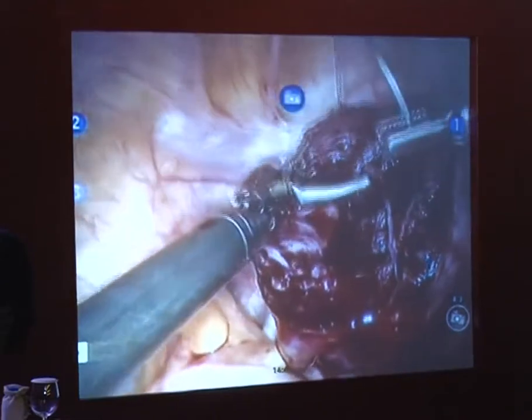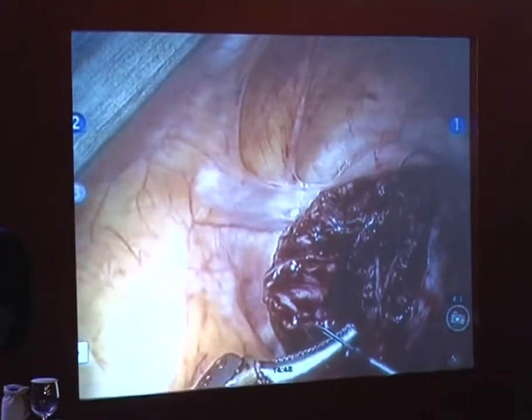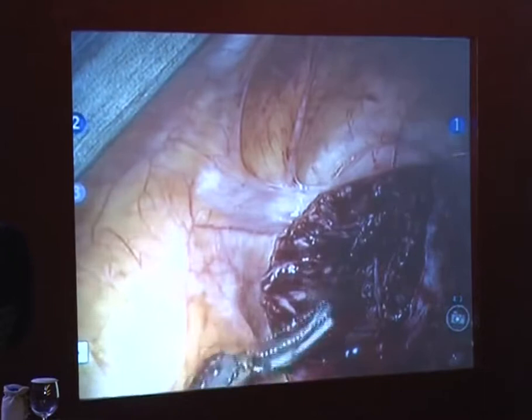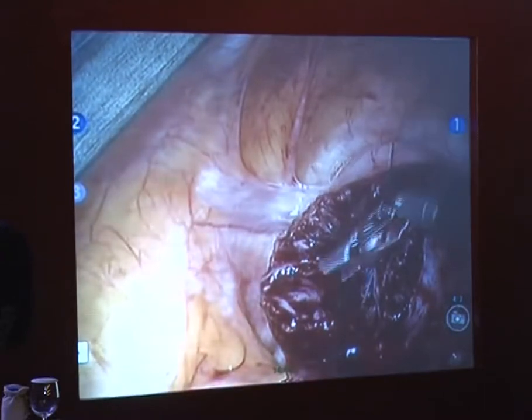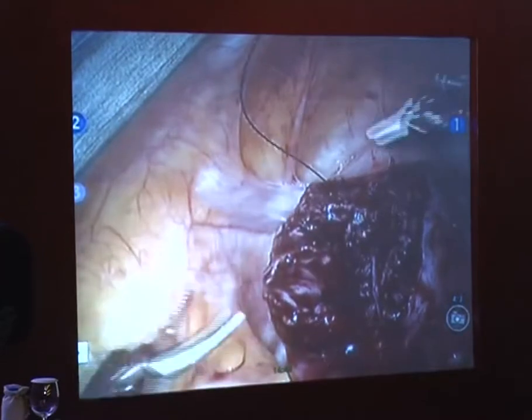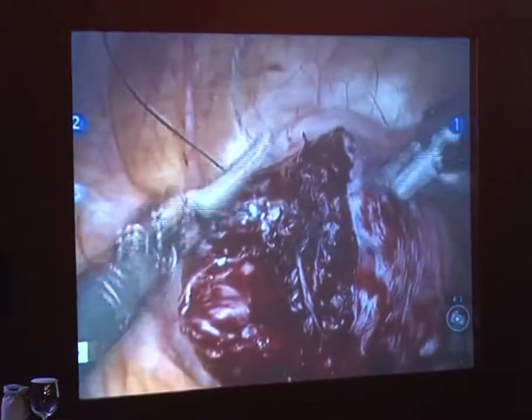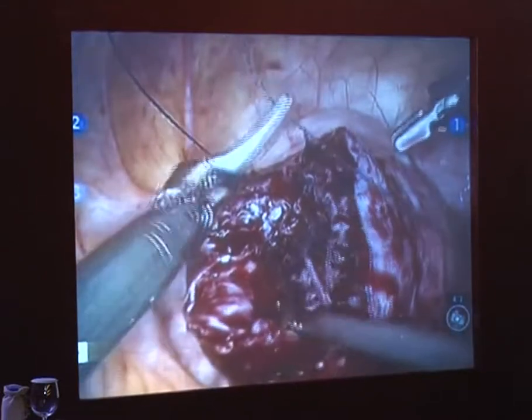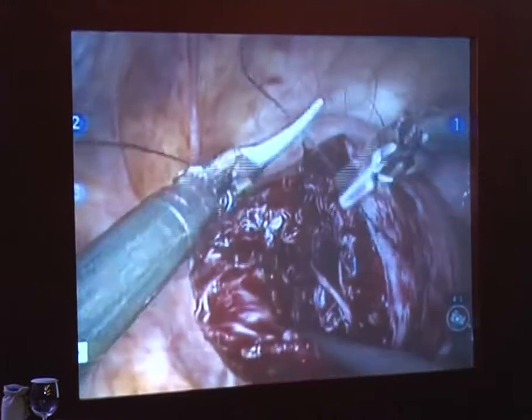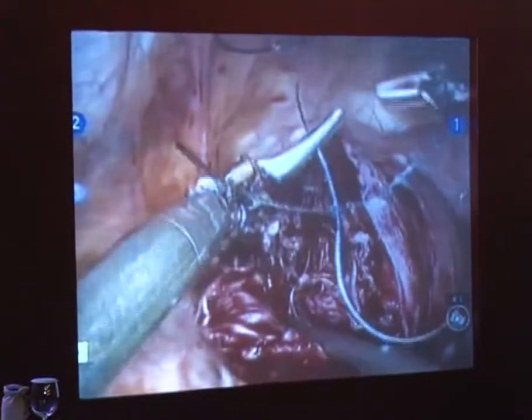Yeah, I mean, you could use the prograsp. I just think it's a little bit aggressive at times in terms of it might crush tissue too much. And I think we have to always think about surgical principle and to not do that to the tissue that we're working with. So I try to avoid things that are traumatic and use the appropriate instrument for the procedure. So, you know, it's just like open surgery. You wouldn't use something like a heavy Bonnie forceps or anything like that on the muscle necessarily.